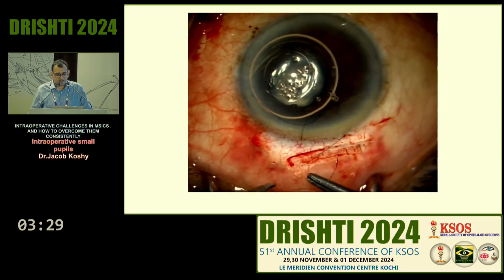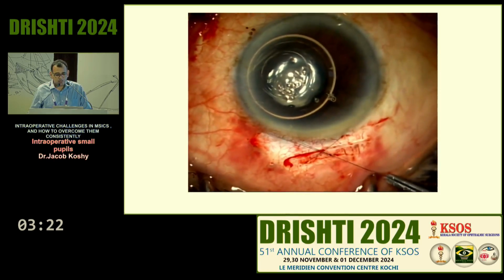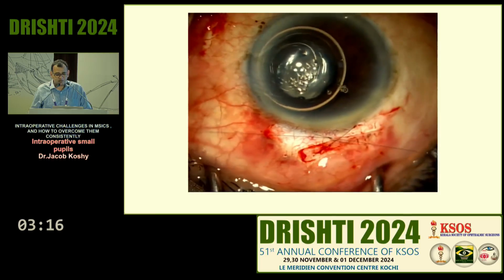It hardly causes any astigmatism. It's just one single cross suture across the breadth of the wound. And you make sure that your wound is absolutely watertight. One thing that you will notice is the air bubble is pretty stable and it's not leaking out.